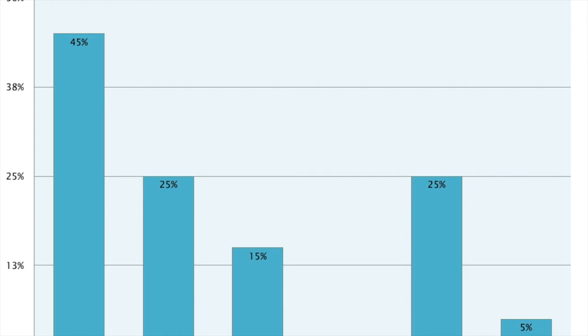What were challenges met? You can see the highest one was the prosthetic slipping often. Okay, so it's so important that you maintain it, that you check that the straps are adjusted, that it's fitting, that the padding isn't shifting, that it's adequately padded, that we haven't lost muscle mass. Refusing to use the limb, you can see in some of these, the prosthetic breaking in some of these as well.